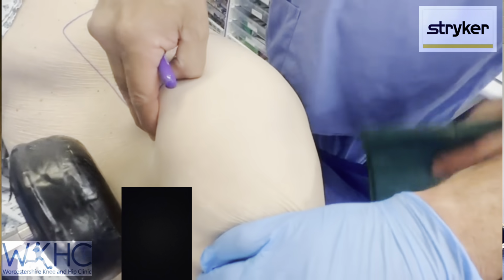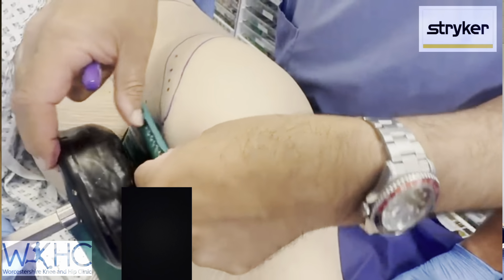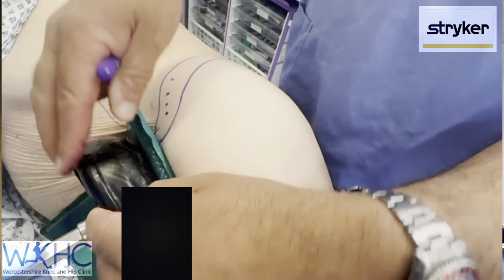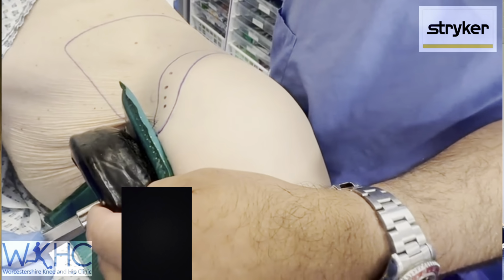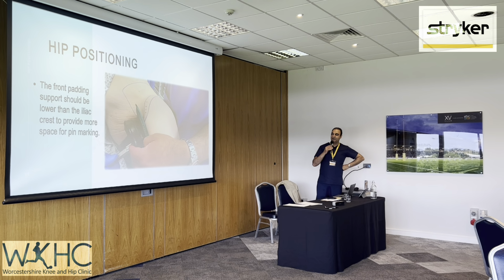So we push that prop in, and we put padding in there, and we make sure that prop is positioned securely over the anterior superior iliac spine, but you have to be able to see the iliac crest. Now I mark higher up so that when you do the prep, they don't come near that area.